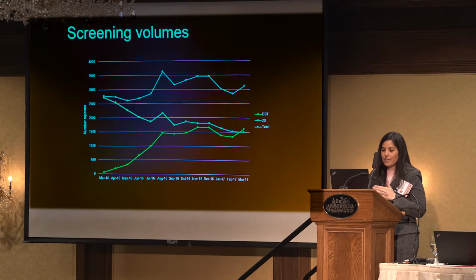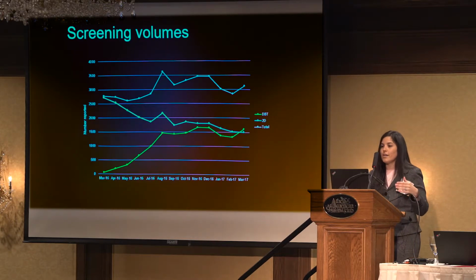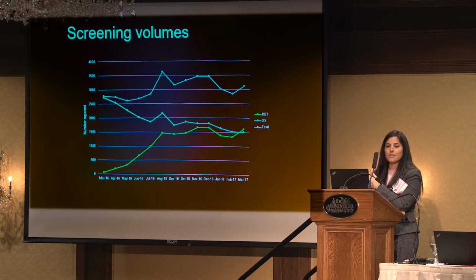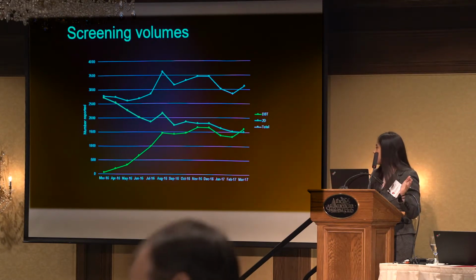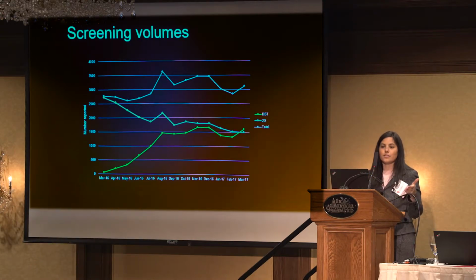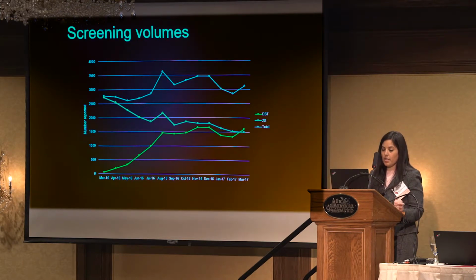This is a snapshot. We did start in March of 2015. However, we did not have a separate exam procedure type for tomosynthesis, so I have no way of tracking those tomosynthesis exams besides a manual process. So this kind of digital process starts in March of 2016 when we started coding bilateral screening mammogram with tomo, or right breast screening with tomo, or diagnostic with tomo, separate from our regular one. So you'll see, a year in, we still have pretty low volumes.